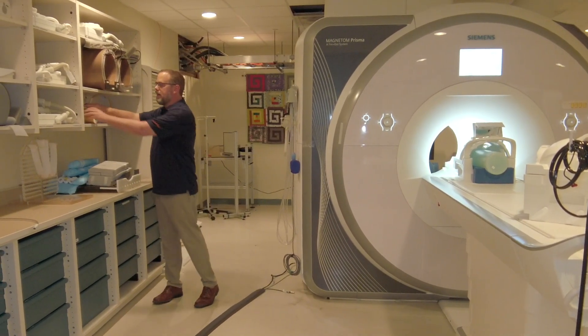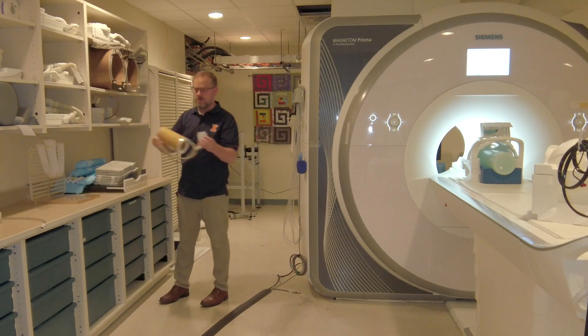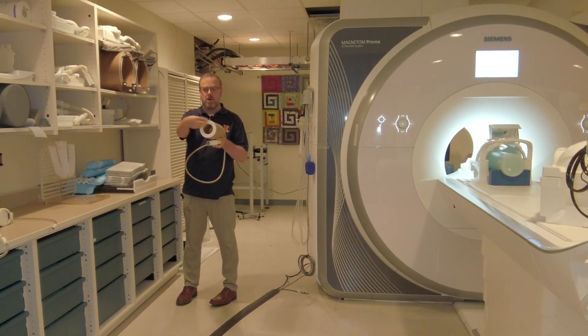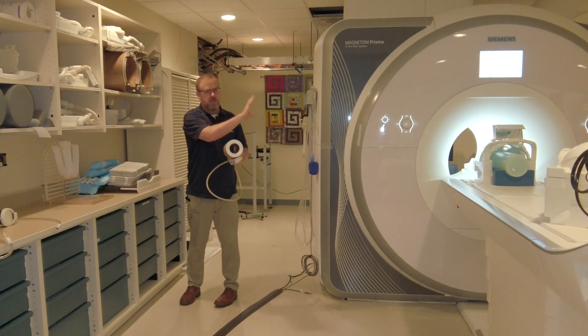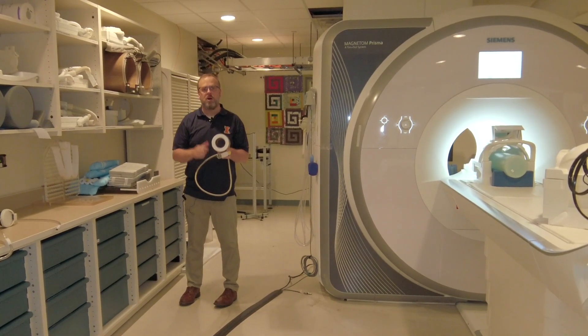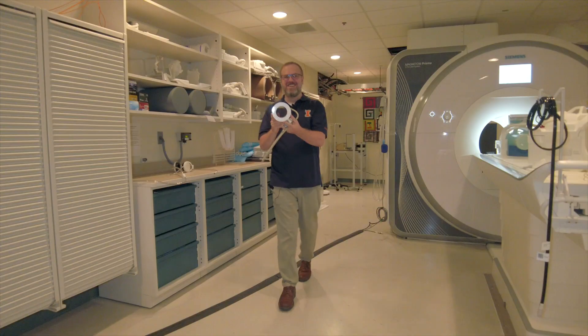We also have other coils that can accommodate a variety of other things. This right here is a small animal coil. You can put a small animal in here, and even though it's a really large bore MRI system, you can image things fairly small, such as a rat, a mouse, or an octopus.